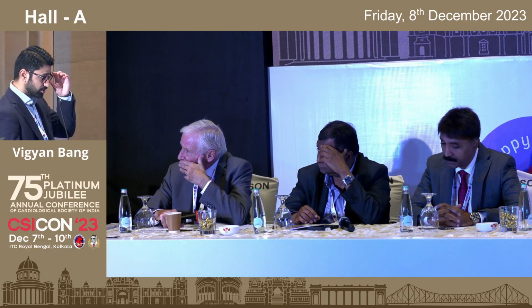Yeah, I agree. I just would like to ask a technical question for you. If you do a valve rupture, how do you select the balloon size for rupturing the surgical valve? The app I use is the app by Vinny Bapat, the Valve-in-Valve app, that gives you the internal diameter, which is usually 1 or 2 smaller than the size of the valve. I also use the CT to see the average, minimum and maximum inner diameter of the valve, and between the two decide which size to go in with.